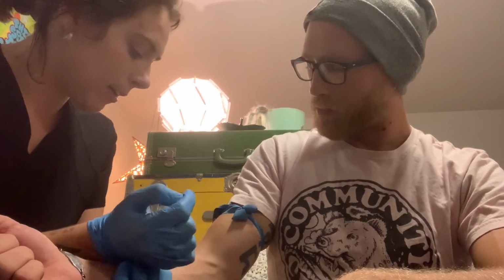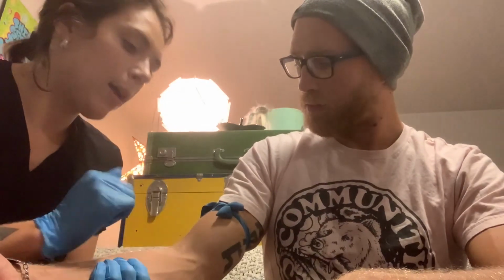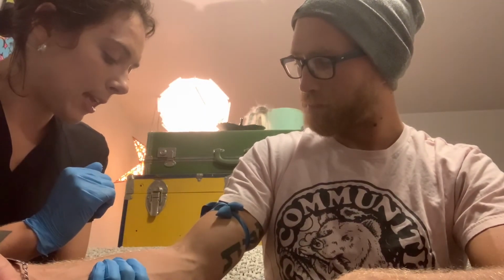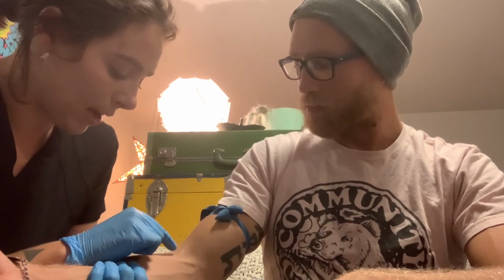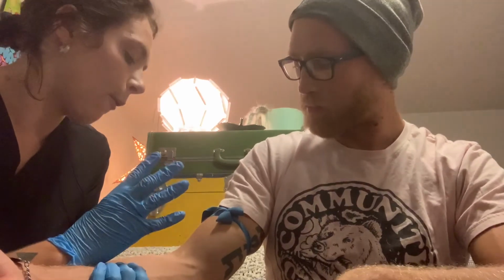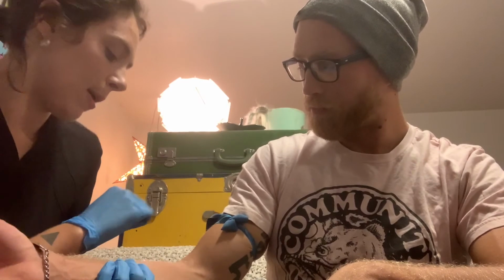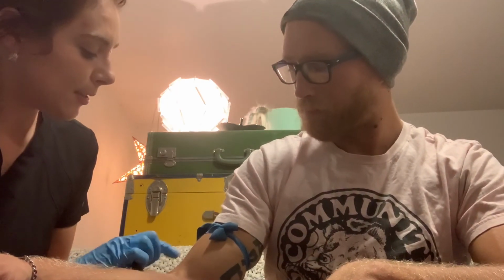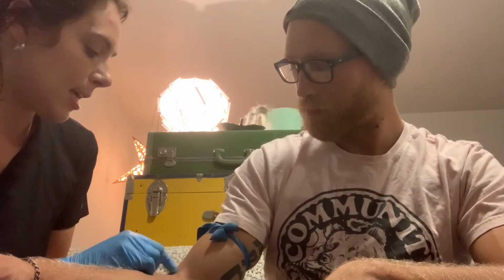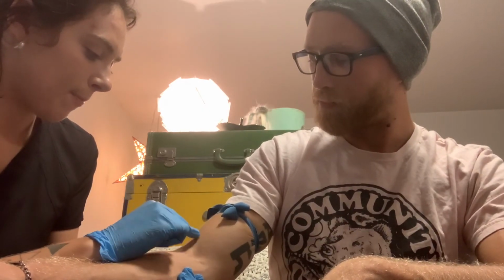So at this point, I've confirmed where I find an arm that won't interfere with his activities of daily living. And while I see this median cubital vein right here, I'm going to avoid that because it's right in the crook, and I want to be making sure that I'm allowing my patient to be the most independent as possible. So I'm noting that soft, bouncy feeling, and this is where I believe I am going to continue with inserting my IV.